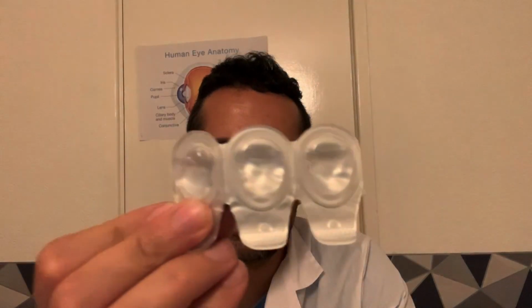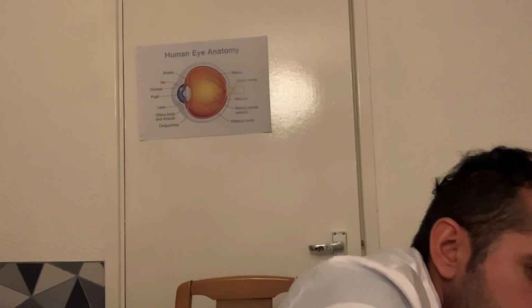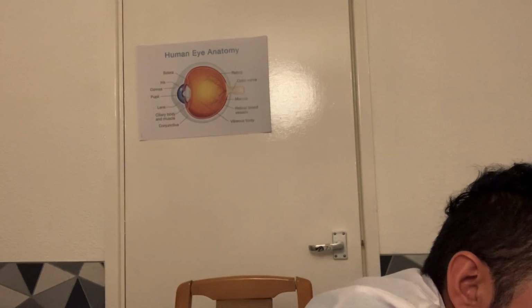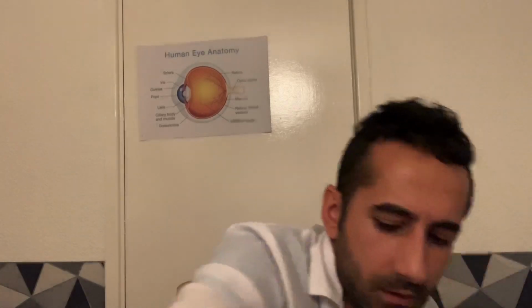Okay, back to your contact lenses. I have selected a reusable lens for you. Selection of lenses there in their solution. Going to wash my hands here. Okay, so shall we insert a contact lens in your right eye?